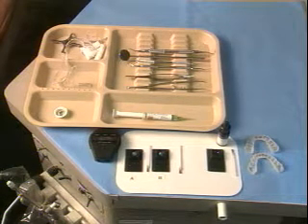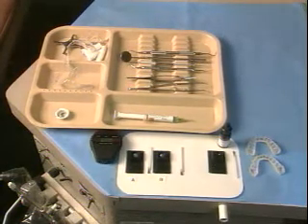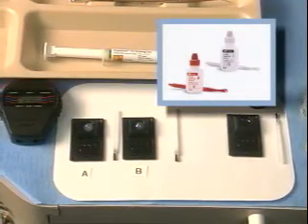Care must be taken to prevent the Sandi Rapid Set Resin A from touching Resin B. Keep the wells and brushes separate. Bottle caps and brush holders are now color-coded to avoid cross-contamination.